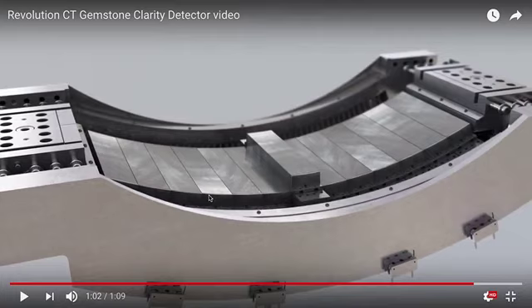The electronics amplification is slightly different in different places, and the X-ray source changes a little bit over time as you're doing a scan. All of those things have to be thrown into a correction. So everything's usually self-normalized in a CT scanner so that you get relative amounts of X-ray attenuation at each one of these detectors.